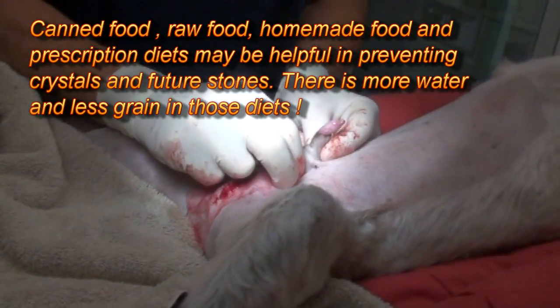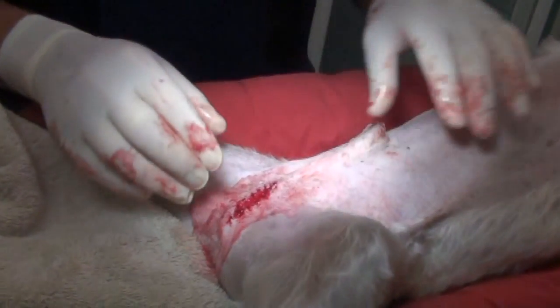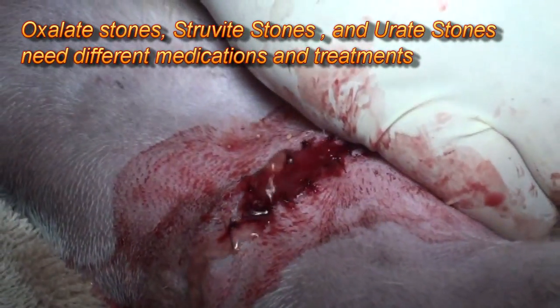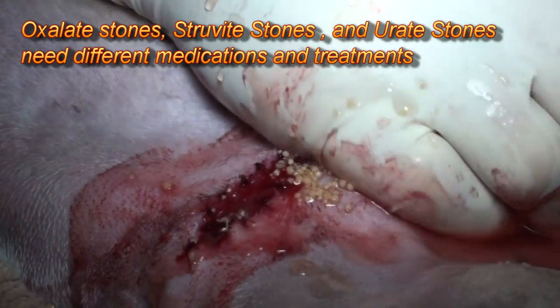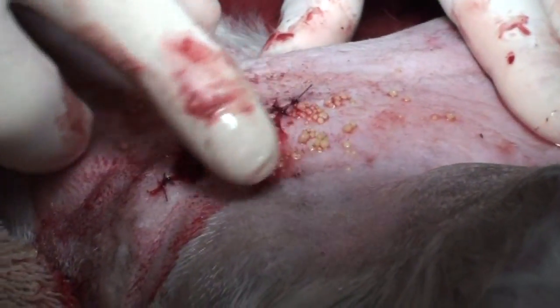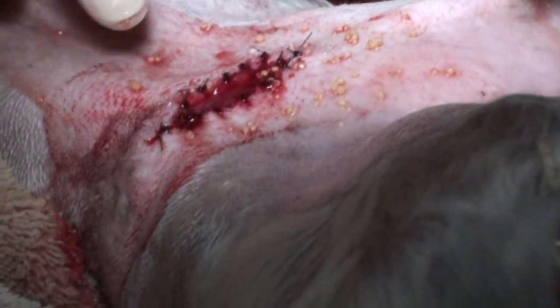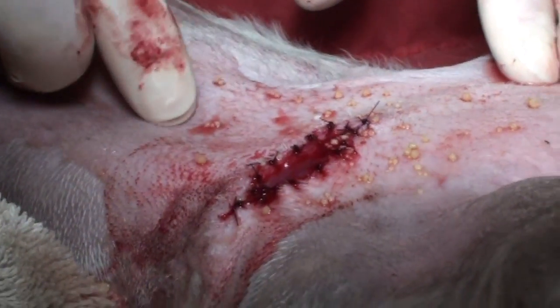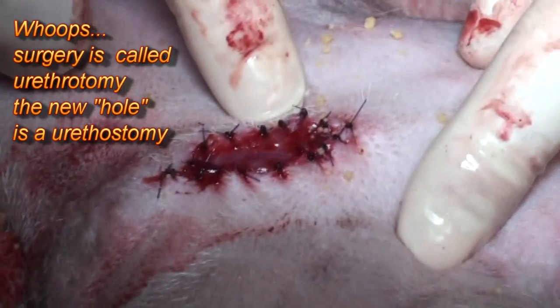It's got a tiny little hole and the bone is small, so they get blocked up there. It's a nice urine fountain — nice stream! Look at all these stones that were blocking up in there. These should come out now with that nice big stream over the next few weeks, and we're not making any more. We're going to send these for analysis — they look like calcium oxalate crystals. There's the nice new pee hole, called the urethrostomy. There's the lining of the urethra in the skin.